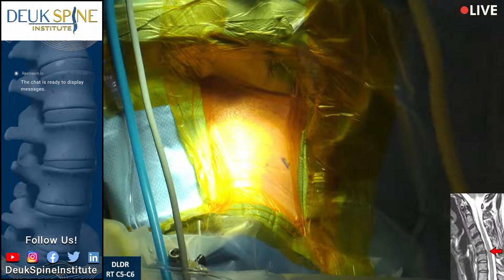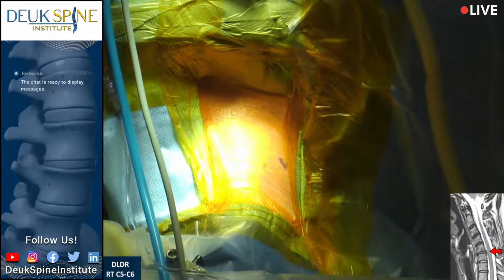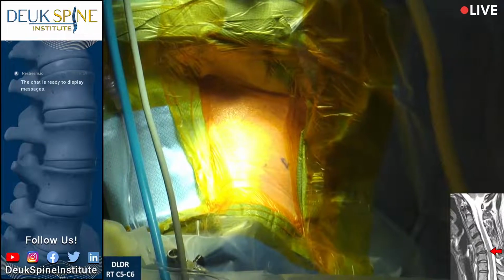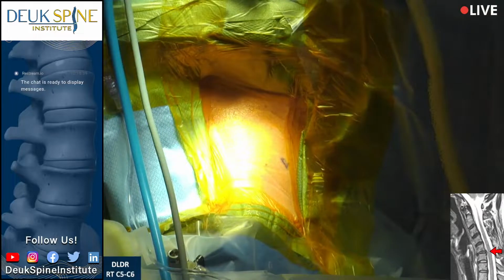Our patient has a herniated disc in her neck. It is at C5-C6, the most common disc to herniate and cause symptoms. Her symptoms are neck pain going into the shoulder and down the arm with numbness and tingling in the left side. We're going to approach it from the right.